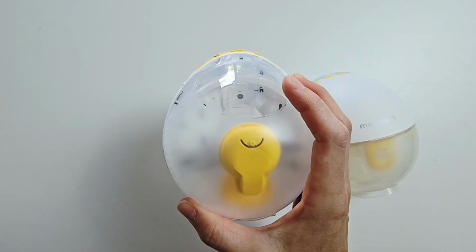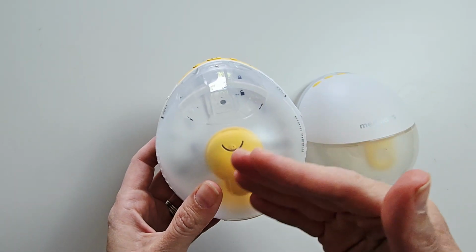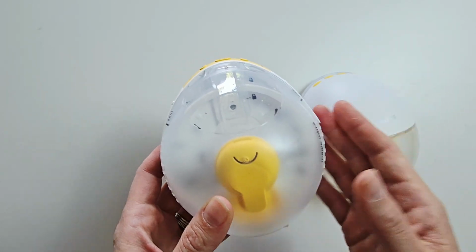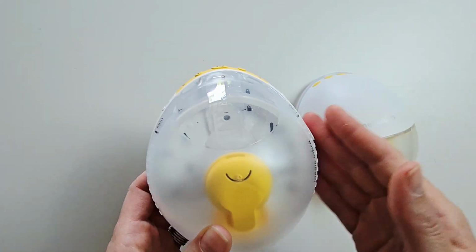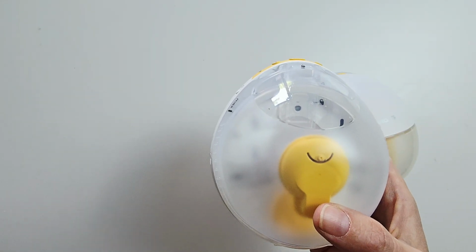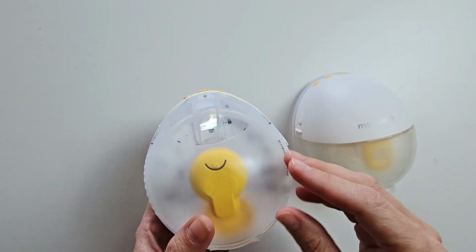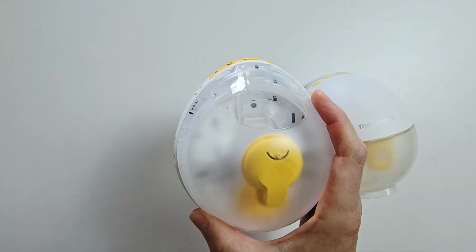That partial drop in practice just makes it feel less jerky at the higher levels, and it gives it this smoother vacuum feel. It can also feel like a deeper suction because it's more consistent. So at the peak strengths, they're the same, but your Medela Magic might give you a stronger suction feel overall. If you prefer the classic pulsed up, down, your Medela Motion is your option. If you prefer that modulated vacuum, that continuous vacuum feel, then the Magic is your better option.